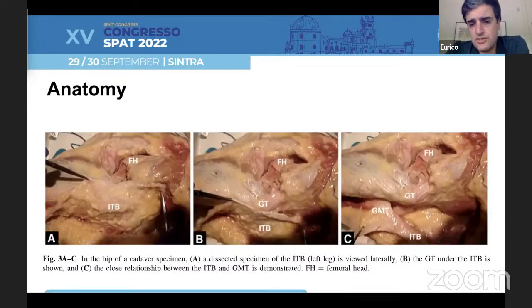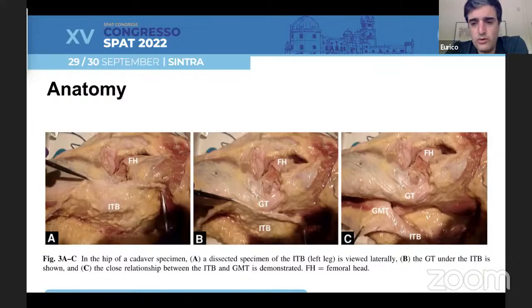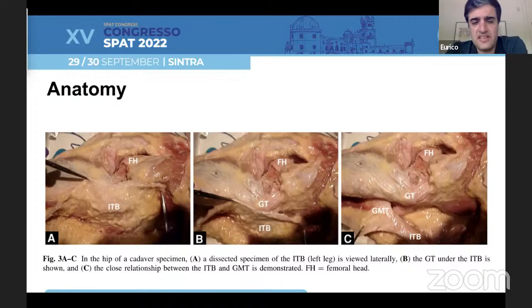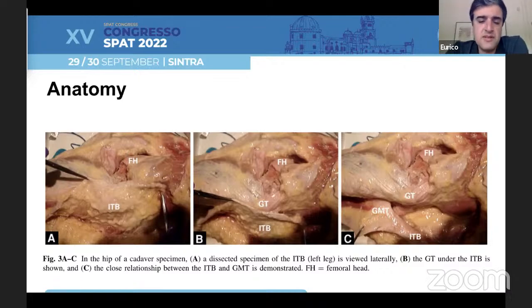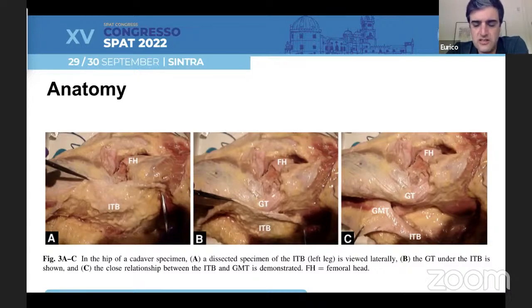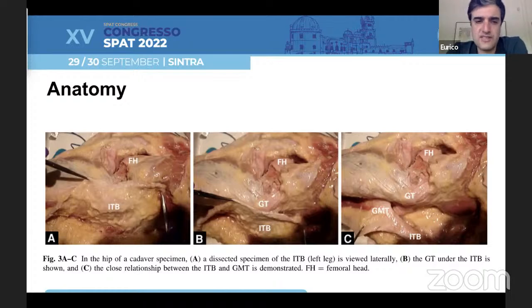It's also interesting to appreciate that there is some contribution from the gluteus maximus tendon when we are talking about this space. Because when we feel that we have a tightened space, mostly like the subacromial space if we use a comparative anatomy, some of these contributions by the gluteus maximus are important, as you will see later. We also address some problems regarding the gluteus maximus tendon.